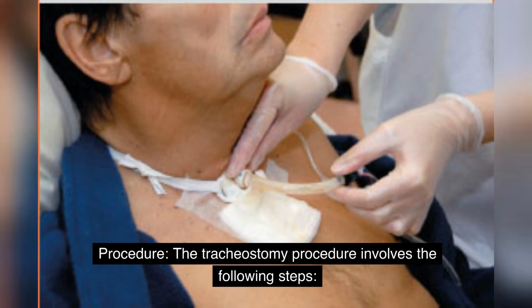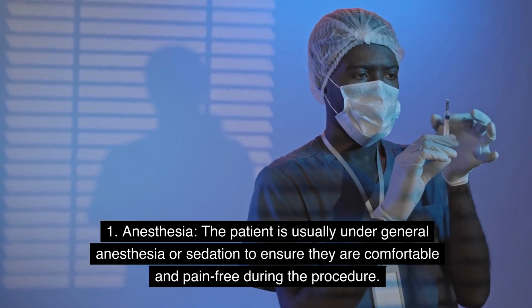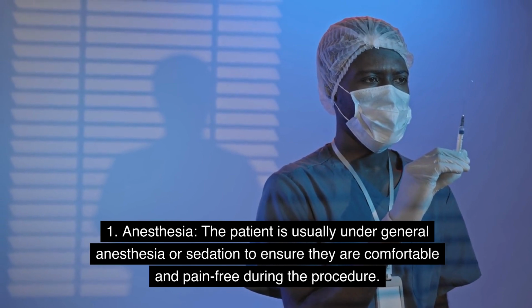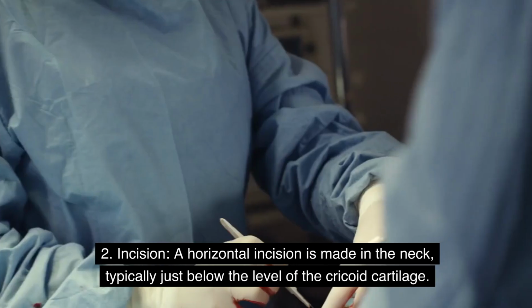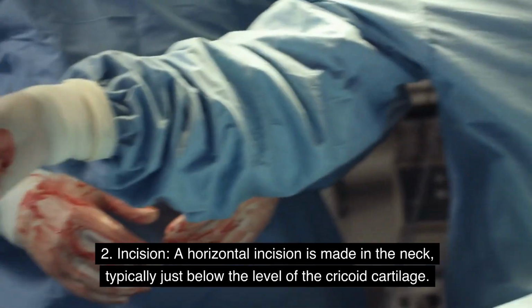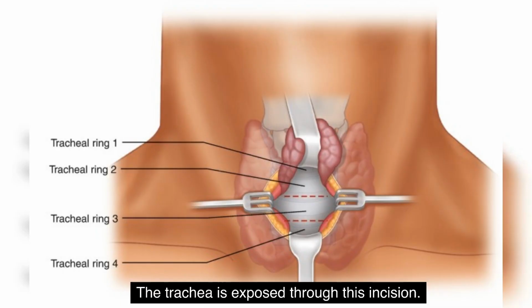Procedure. The tracheostomy procedure involves the following steps. 1. Anesthesia. The patient is usually under general anesthesia or sedation to ensure they are comfortable and pain-free during the procedure. 2. Incision. A horizontal incision is made in the neck, typically just below the level of the cricoid cartilage. The trachea is exposed through this incision.